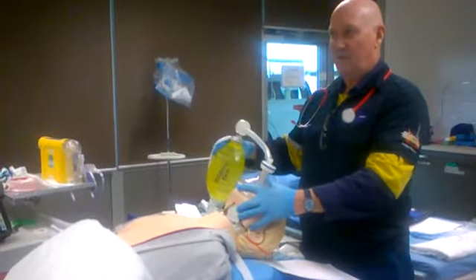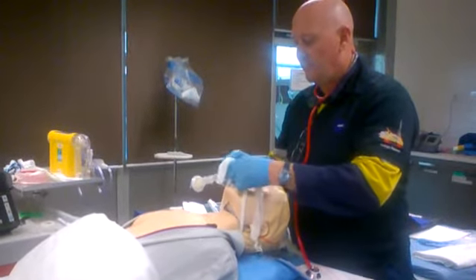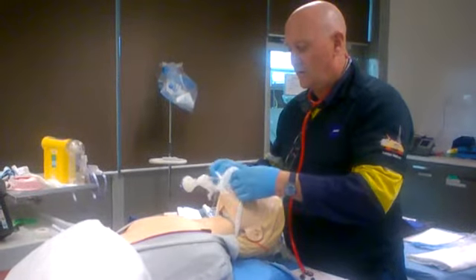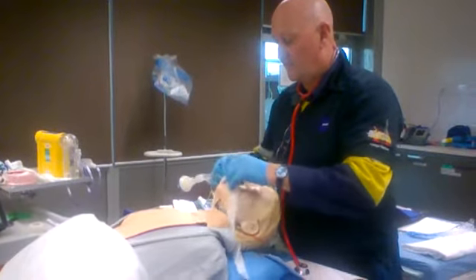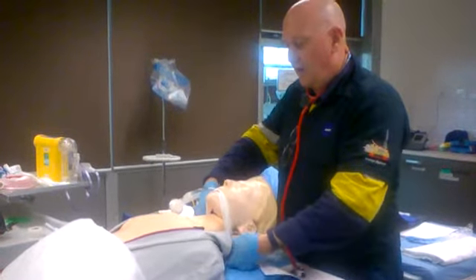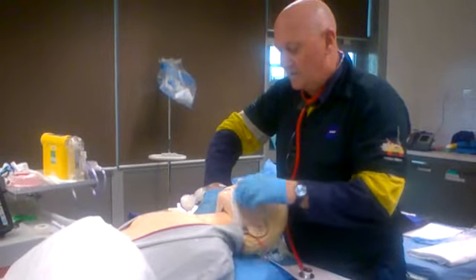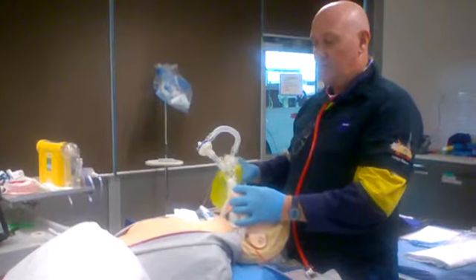So then we tie it off. We would go around the head and tie it off underneath. I don't have one of those intubation tube holders, I've only got some bandage. So, hold the tube, secure.